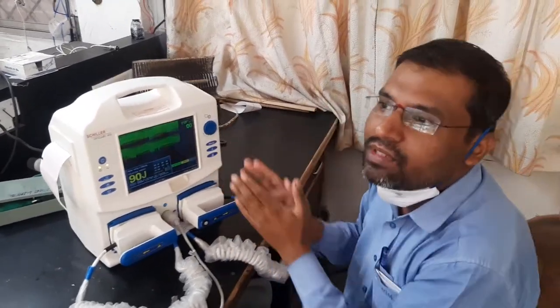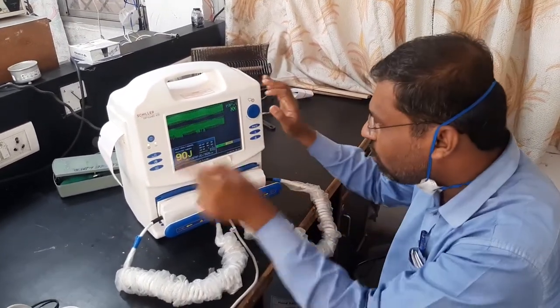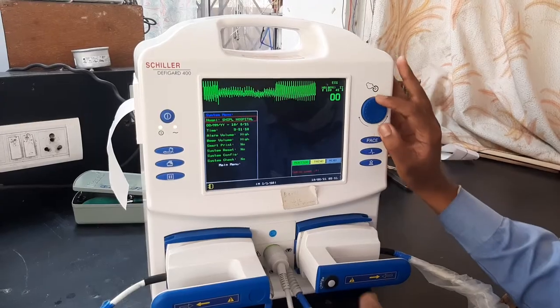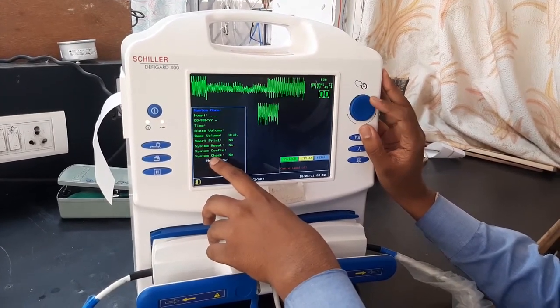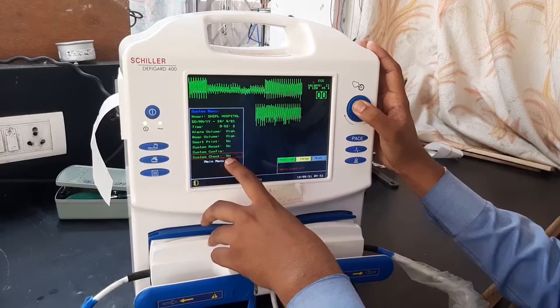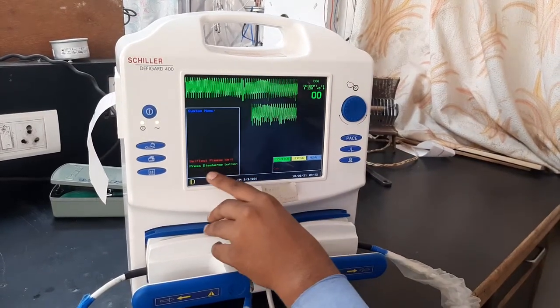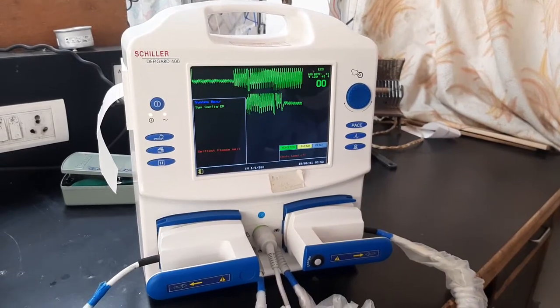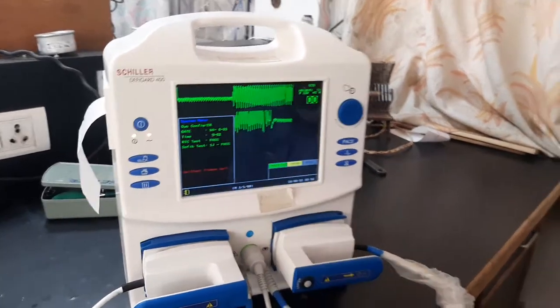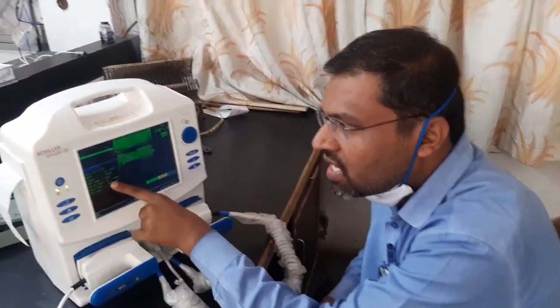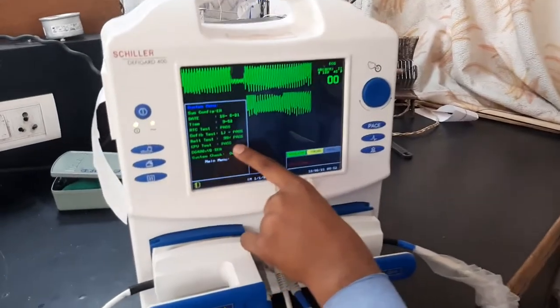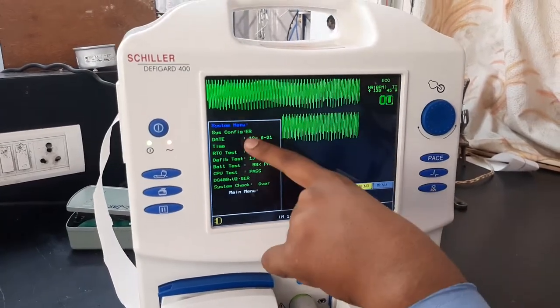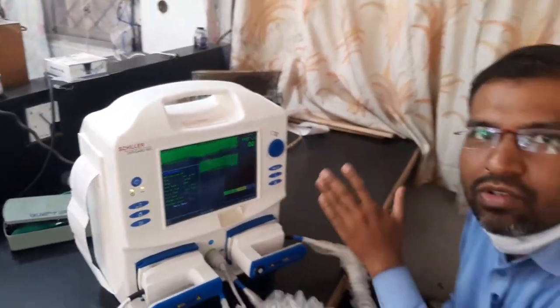One more thing — if you think there is a problem inside the machine, there is a self-test protocol. Go into menu, go to system, and at the last option you will get 'System Check.' Select self-test and press both discharge buttons simultaneously. Self-test is in progress — RTC test pass, defibrillator test pass, battery test pass, CPU test pass. System check complete — there is no problem inside the machine, everything passed. This means the machine is ready to use.